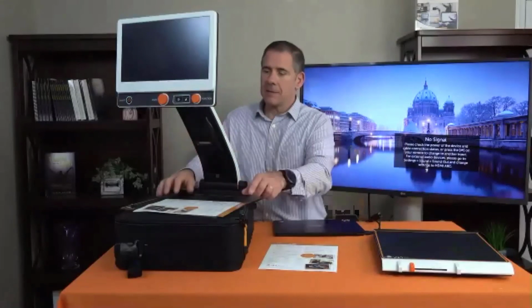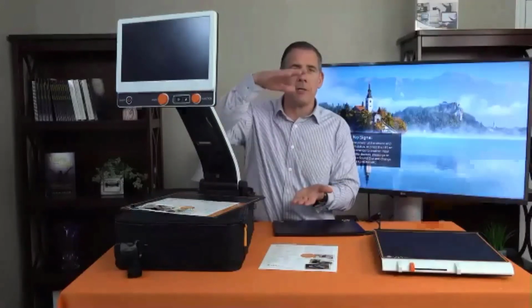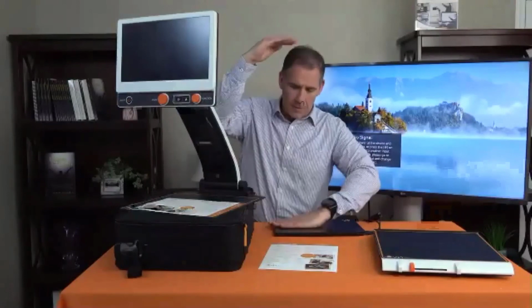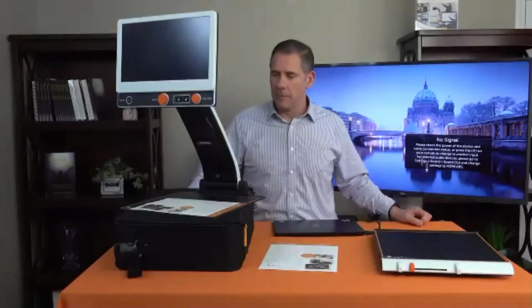Now, that's with the 1080p camera. The drawback of the 720 camera is it will never do full page scanning, and that's the aspect ratio from camera to the distance, this distance here. It can't get a wide enough view because of the limitations of a 720p, which is pixel progressive scanning and stuff that we don't need to know. But I just wanted to make that distinction for you.